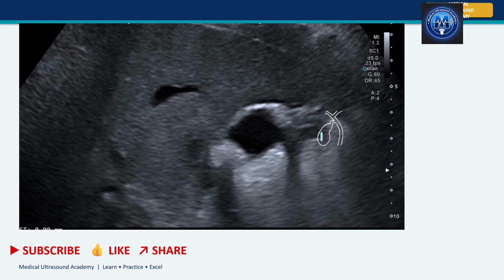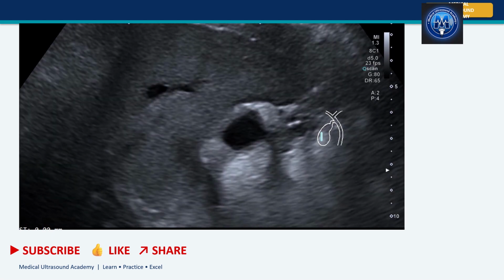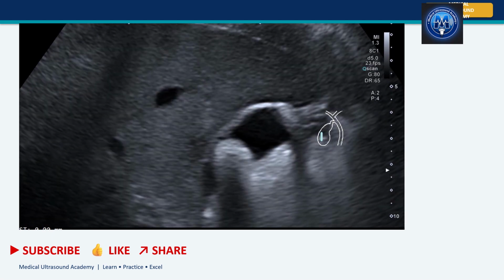So what we have here is a characteristic gallstone. You can see it there. This is the gallstone that we're having. Looking at our case, we can already appreciate a very important feature: an echogenic structure within the gallbladder, which is producing prominent posterior acoustic shadows, as you can see here. You can appreciate the distal acoustic shadows that we are having there.